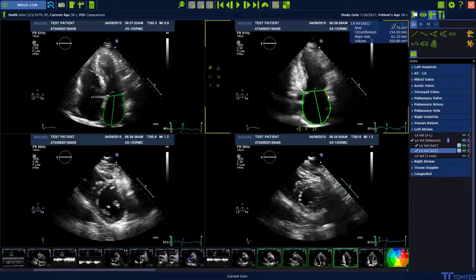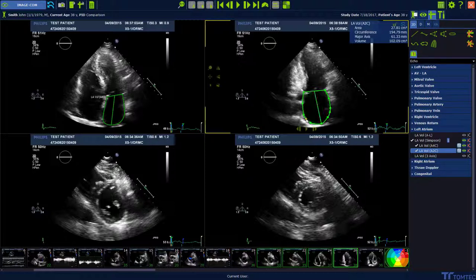The contour can be adjusted manually, so you can move the contour via drag and drop and adjust it. You can add single points with a left mouse click, and you can also remove a point with a right mouse click.